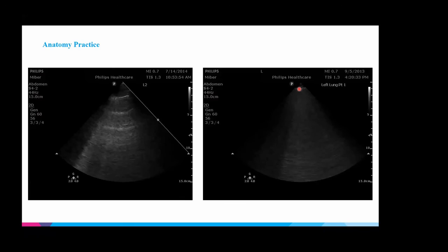And is that like a long rocket? Yeah, so B lines, there are lots of different terms. You can use rockets that come down from the pleura, or you can use spotlight. I personally use spotlights just because it helps signify that they're bright white. But we use more linear rockets versus more confluent rockets. So it's just a matter of whichever terms you guys prefer.